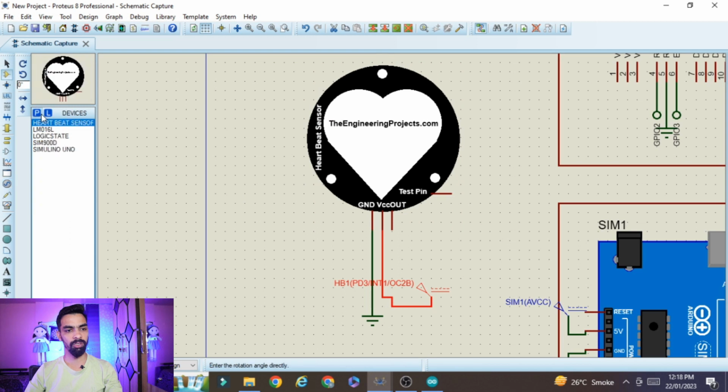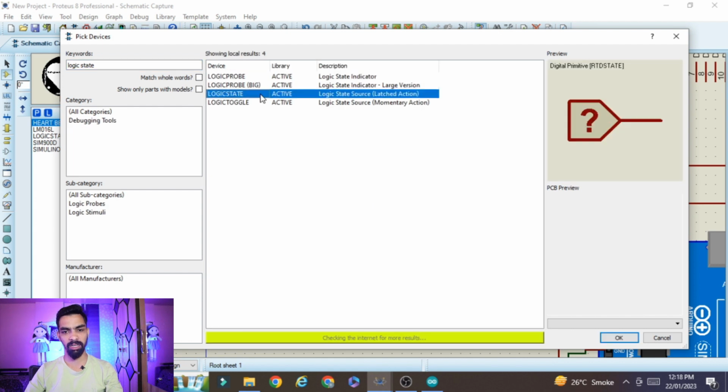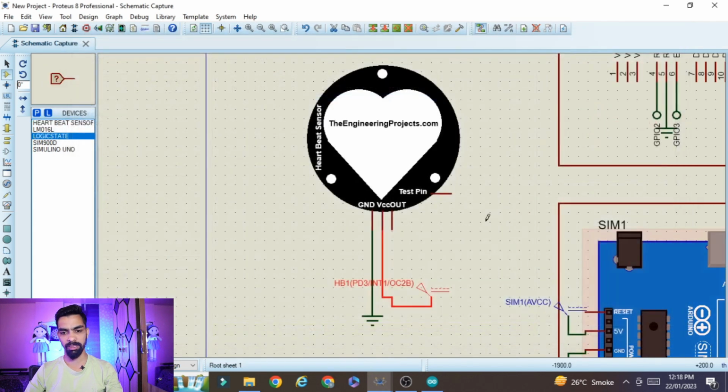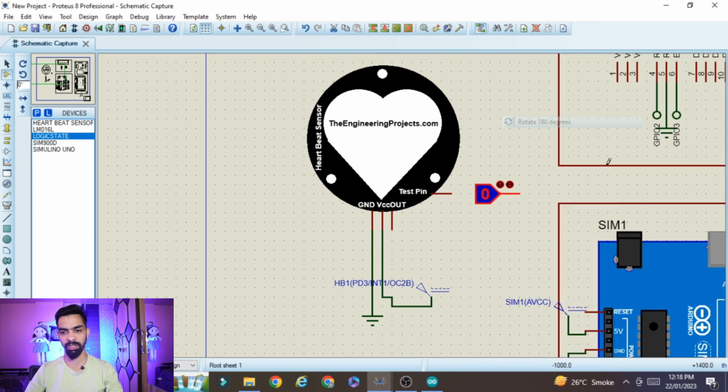So go to component mode, click on P, and type here logic state. Then select any logic state like this and click OK, and place that logic state here. Then double click on this and rotate 180 degrees. Then you can connect this logic state to this point.